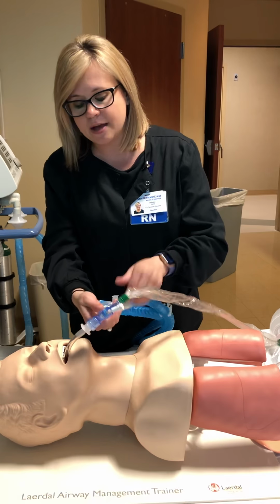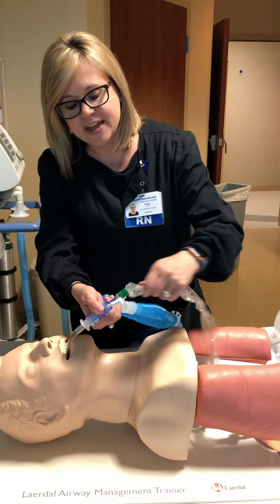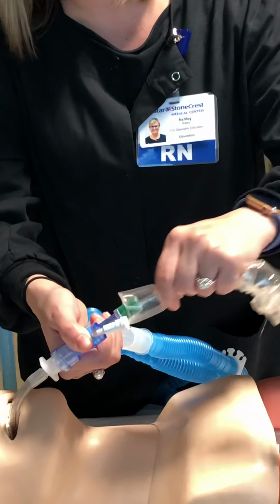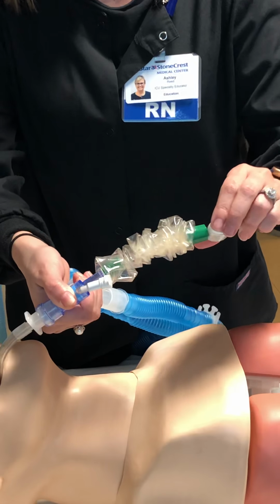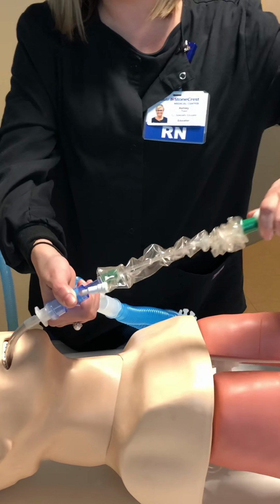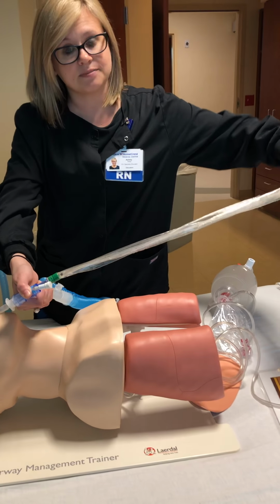So your O2 breath or 100% FiO2 has been given. Now you're going to grab the ET tube to help guide it in, and you're going to start advancing the inline suction catheter. You're going to go until you meet resistance. When you meet resistance, pull back 1 to 2 centimeters, and then start pressing the suction button intermittently as you pull out, okay? This should take less than 15 seconds.